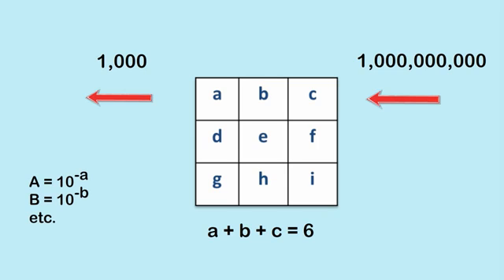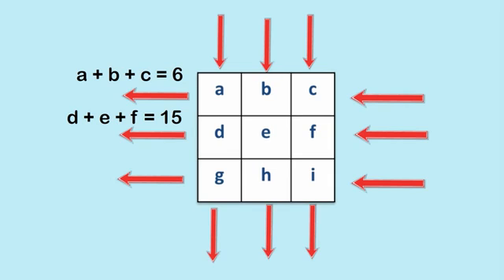But safe in the knowledge that just because we've just taken logs, if we can work out the small letters, we can work out the big letters, and once we've worked out the big letters, we can draw the CT scan. Now, the fundamental problem, of course, is that there's still an infinite number, essentially, of solutions to this problem. We could have 1 + 1 + 4 = 6, or 2 + 2 + 2 = 6. And the way that we solve to find out what A to I is that we need more X-rays.